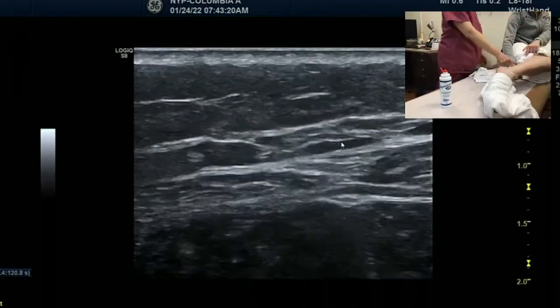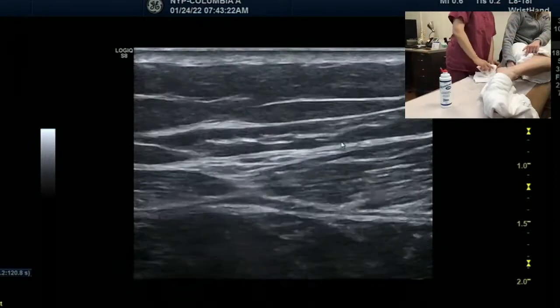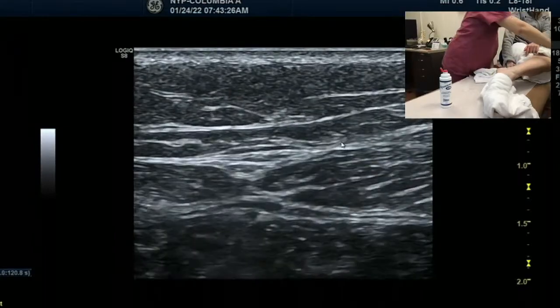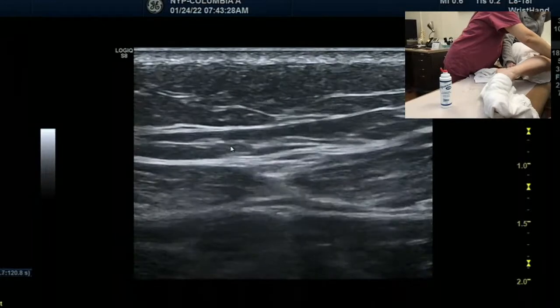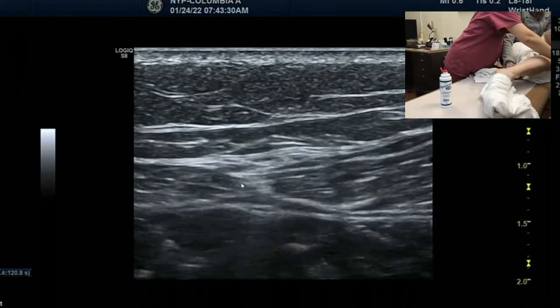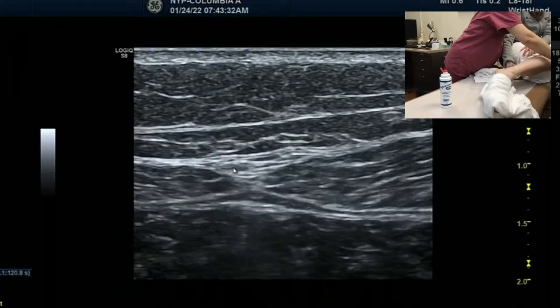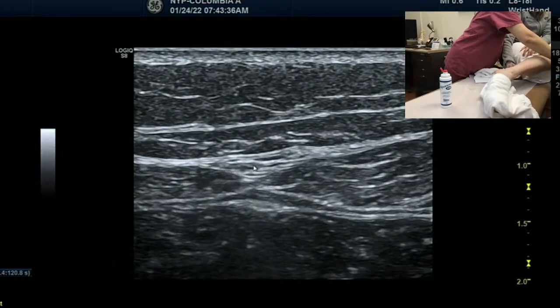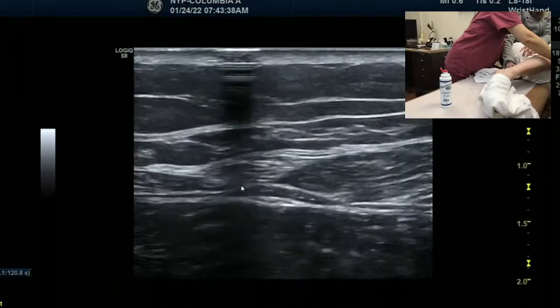So now her leg is in. The probe is in the middle. And you can see the two heads of the gastroc and everything. This is the head in between, so it must be this one now. Because you scanned up. I missed that part. So scan down a little bit so we can see together.